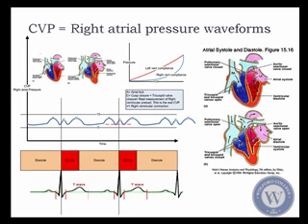Now this is a drawing that I've made for you guys to help you along. What I'm working with first is walking your way through from the right atrium all the way to the left atrium, eventually to the aorta. The first cavity we enter using a PA catheter would be the superior vena cava and then the right atrium. What we call the right atrial pressures clinically is the central venous pressure, the CVP. Basically, you're monitoring right atrial pressures. And the waveform generated from this, when you look at it at a scale of 30, shows A, C, and V waves.